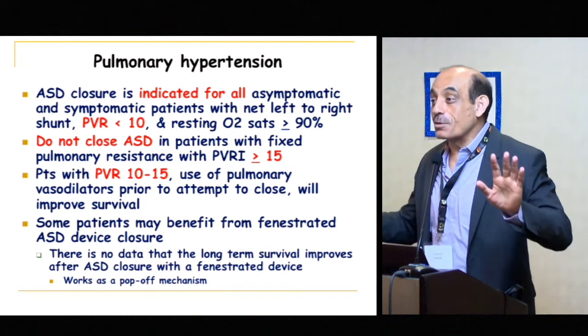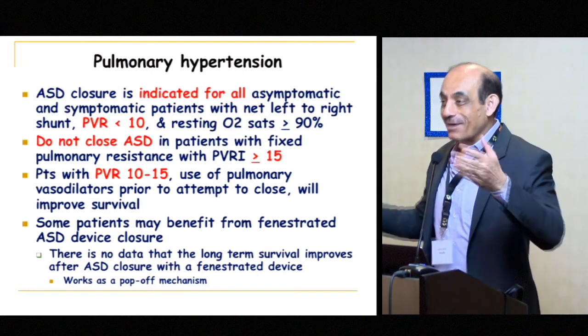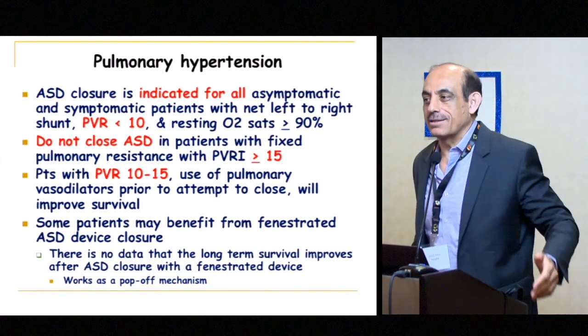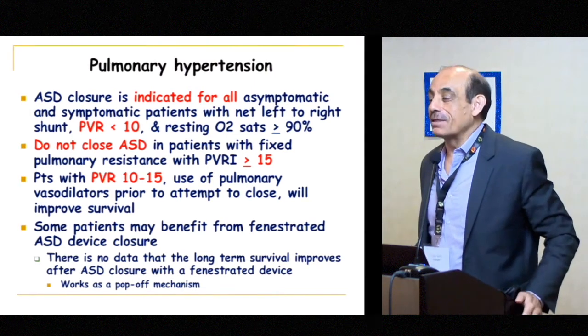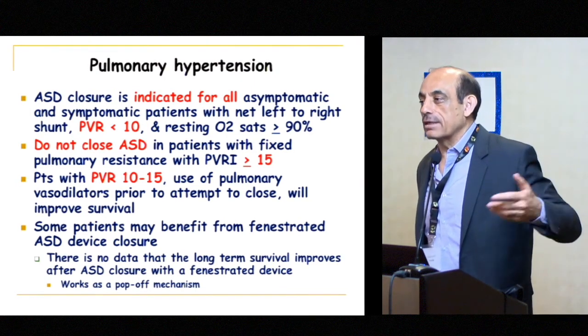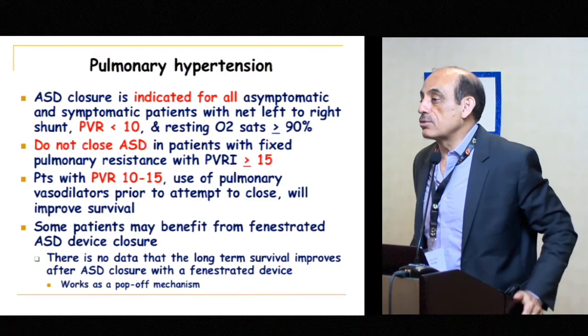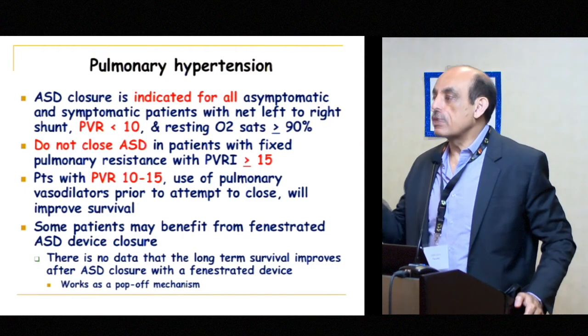So we can have a war zone here. So, you literally asked the question, which I probably should have abstained from saying that sentence. I don't balloon size. There are many people who are like me who don't balloon size. There are fantastic people sitting here. They always balloon size. I think the best thing is what you feel comfortable with.